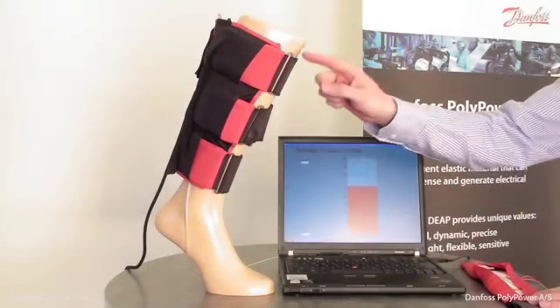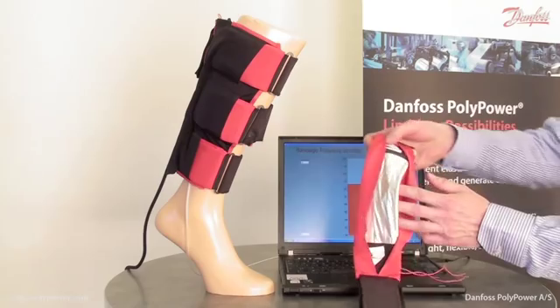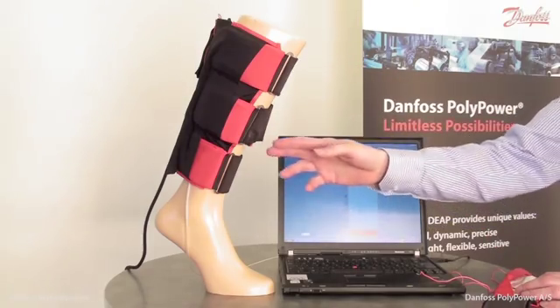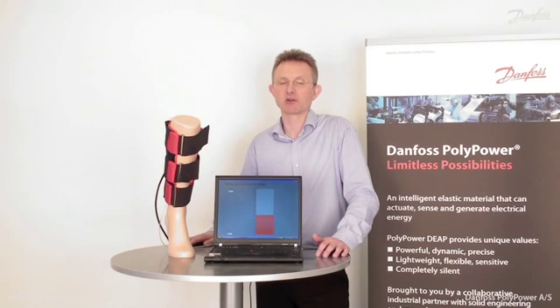The bandage is designed with three compliant linear actuators, just like the one I'm showing here. The bandage can operate either in unison or in sequential like a peristaltic pump. On the screen it is shown how the bandage is working. Applications for active compression bandages are found within medical and within sport and leisure. For more information please visit us on www.polypower.com.